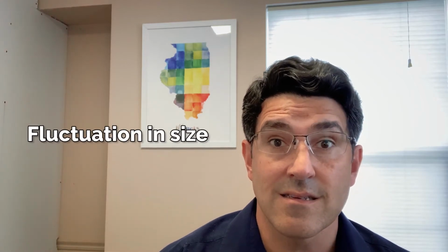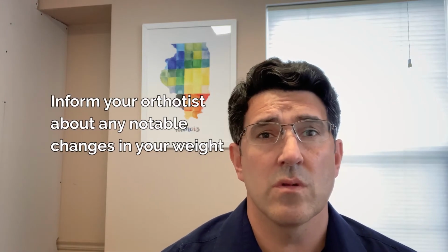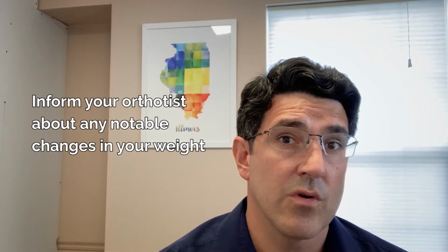Other issues that you might run into are a fluctuation in size. That can be a very important thing. Sometimes people lose 10 to 15 pounds. Sometimes they gain it, or more or less, whatever the case may be, but the brace doesn't change size, right? So if you lose 10 to 15 pounds or gain it, tell your orthotist, and maybe they can do something with the brace to heat relieve a certain part for you, or maybe if you have edema in the foot, for example, then they can heat relieve it, to help accommodate some more space in there. The other downside to that is if you gained 15 pounds to start with and then lost it, and now they heat relieved it the first time, now it might be large. So just have the conversation with them, and that can go a long way for you.